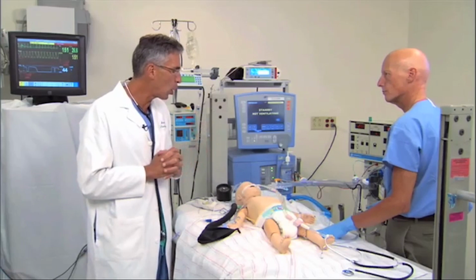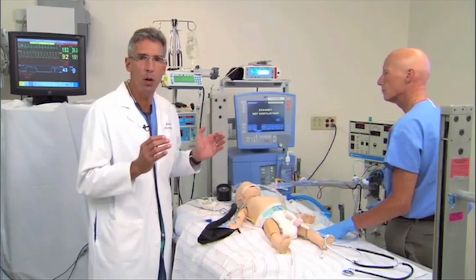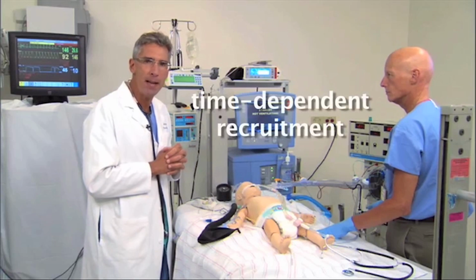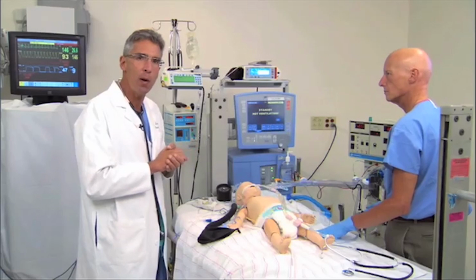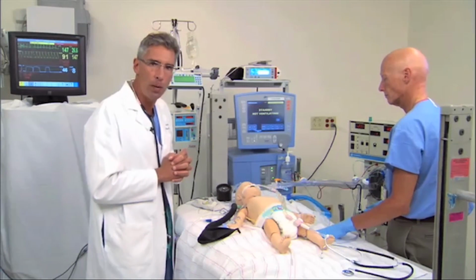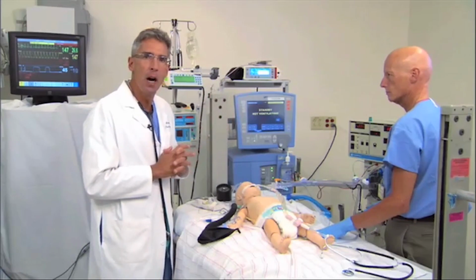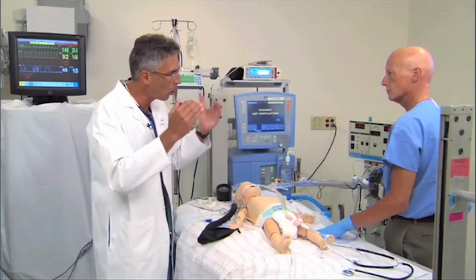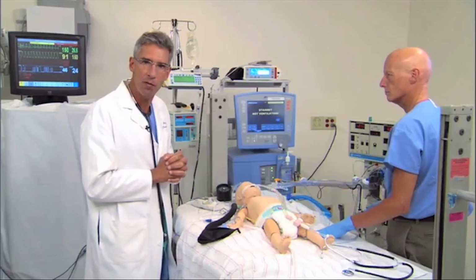And a couple of other cautions. At this stage, I think it is worthwhile to be patient, both with ventilator changes and with blood gases. There is a time-dependent recruitment phenomenon, particularly in larger patients, whereby increases in mean airway pressure may take some time in order to generate alveolar opening. And similarly, small changes in the delta P may take a while before alveolar ventilation is improved enough to lower the CO2.